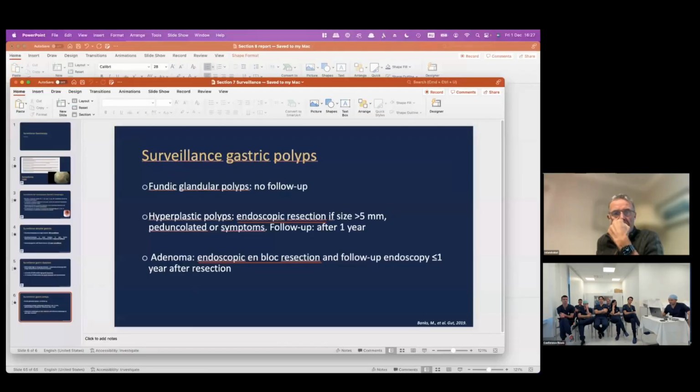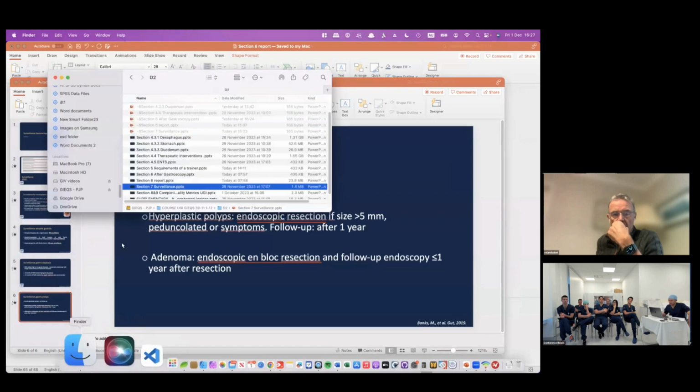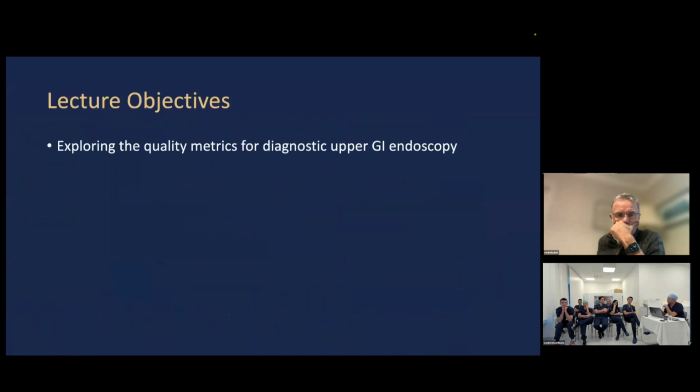And then finally, I want to cover KPIs. I think somewhere we should be going is what Roland said, that you put structured data into a reporting system, and then out of it comes some data, and it should be KPIs. You should be able to have your personalized scorecard, like Montori does 100 gastroscopies and he gets a scorecard. Smith does the same, he gets his scorecard, and then the boss of the department has everybody's scorecard.